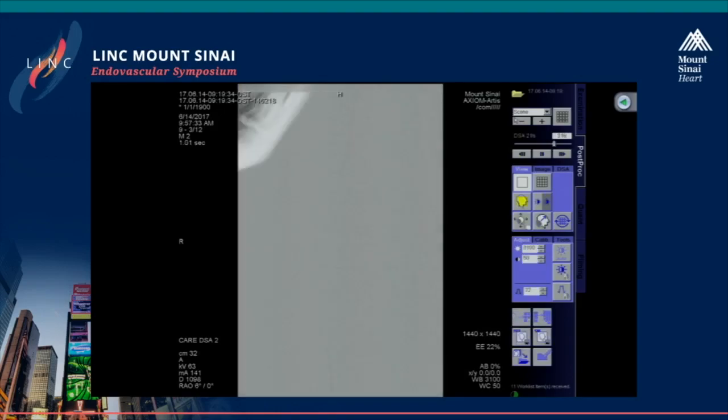And then we got down closer, and this is the most important thing for everybody out there: you want to identify the cap and see what's coming out. If you look at this, you have multiple collaterals coming out at the level of the cap, which is going to make it a little bit more difficult, and that's where a steerable catheter has helped. As far as wires, just to build on what Dr. DeRobertis was talking about, if we don't identify calcium angiographically, we tend to go with hydrophilic wires. And if we identify calcium, our go-to is usually the Connect 250T.